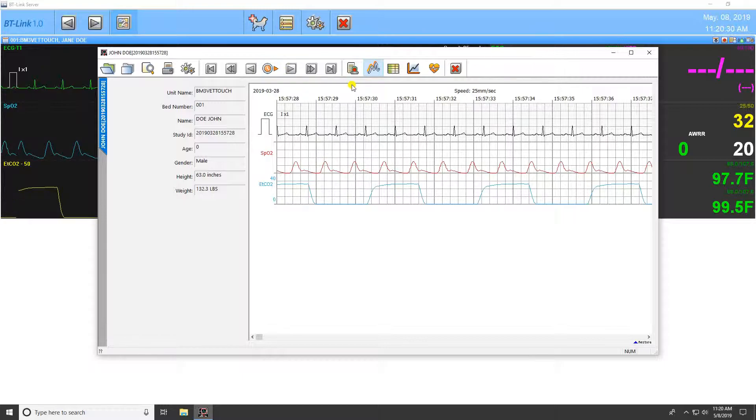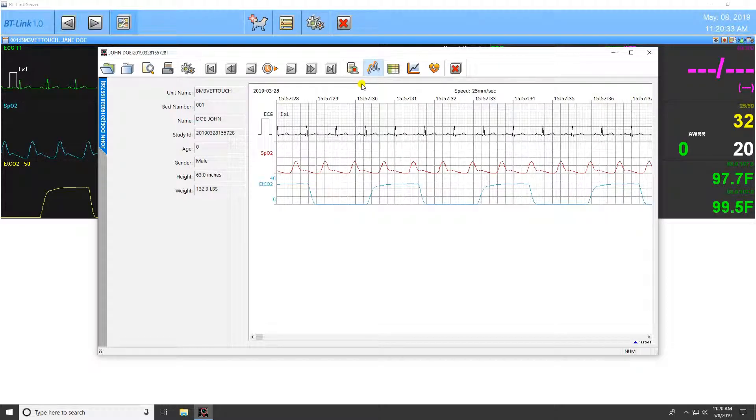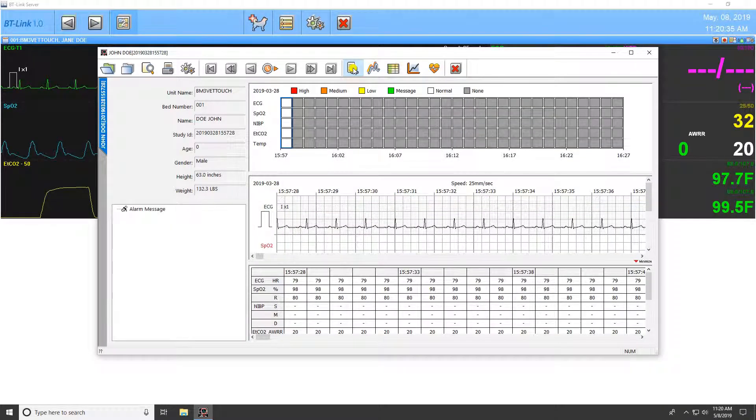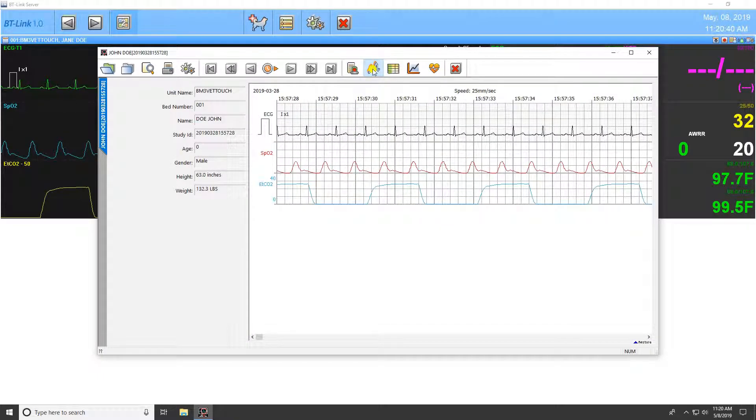The next five icons allow you to change the display method of the currently selected study. The first icon is the alarm view, which allows you to review any alarms that have gone off during the time of recording.